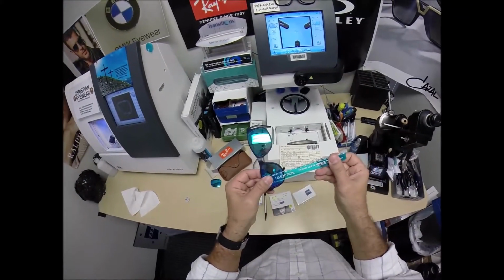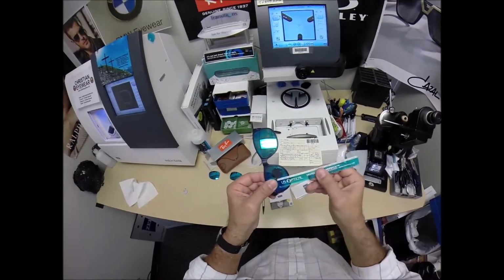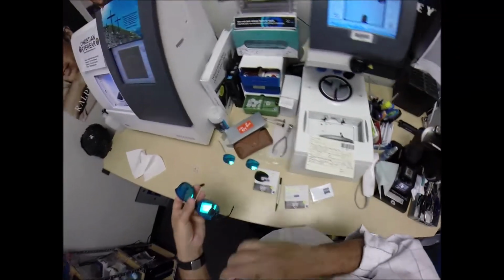Optical center height of 24, not to the bottom of the lens, but to the thickest part of the plastic, and we're getting 24. So that is cut perfectly.